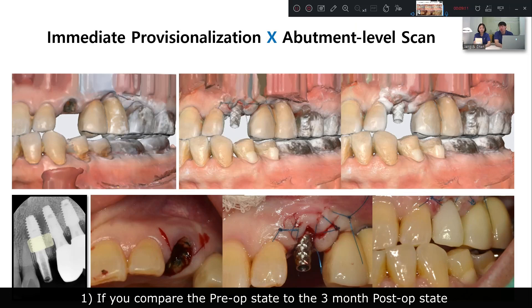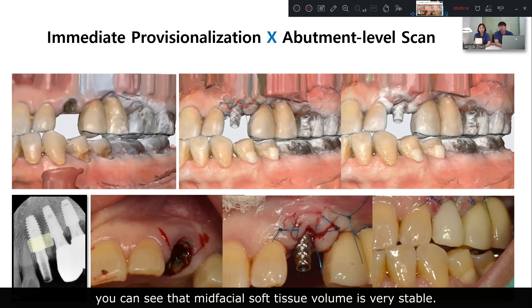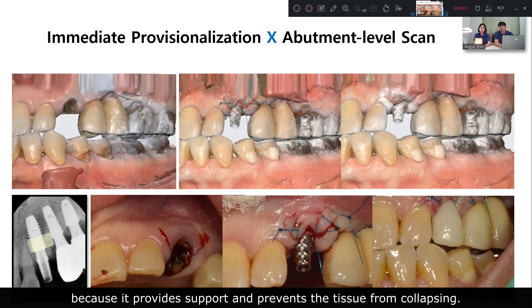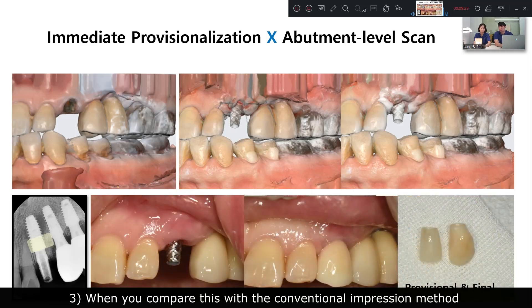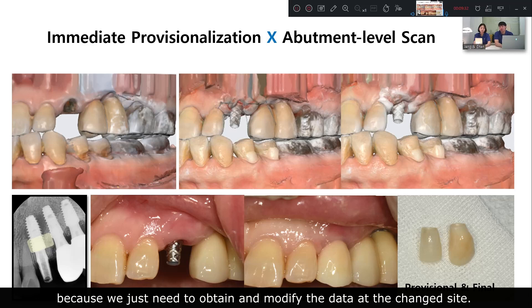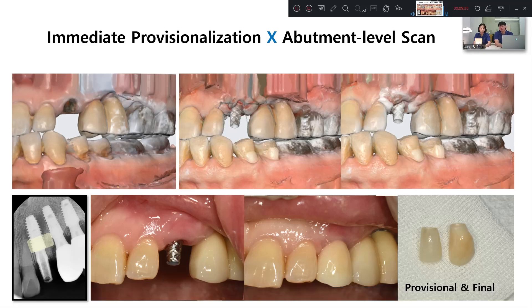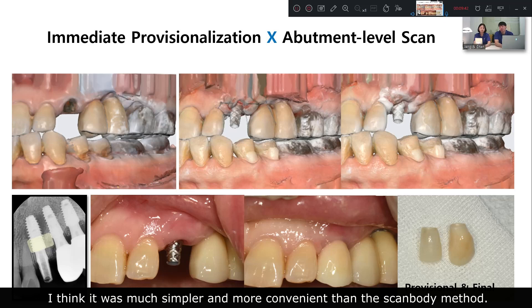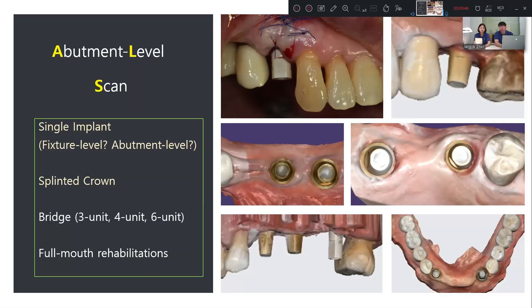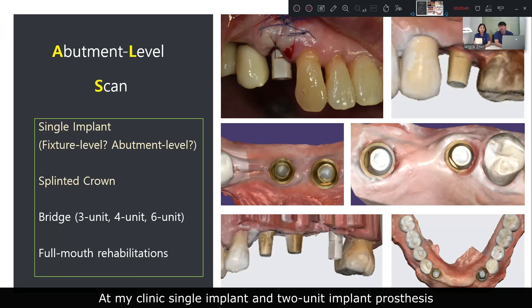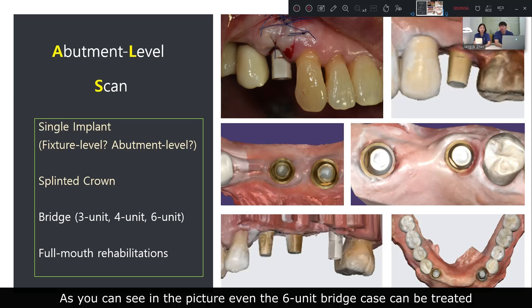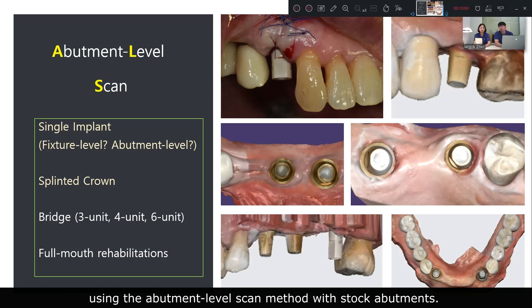If you compare the pre-op state to the one-year post-op state, you can see that the facial soft tissue volume is very stable. This result proves the benefit of immediate provisionalization because it provides support and prevents tissue from collapsing. When you compare this with the conventional impression method, digital technology makes the process much easier because we just need to obtain and modify data at the changed site. Because the abutment-level scan method was used, it was much simpler and more convenient than the scan body method. In my clinic, single implant and two-unit implant prostheses are mostly treated with stock abutment, and even a six-unit bridge case can be handled using the abutment-level scan method.